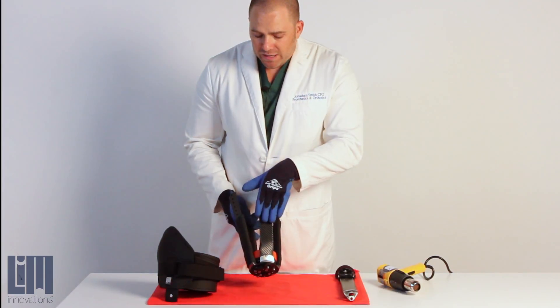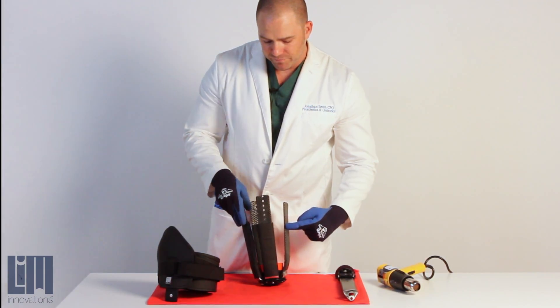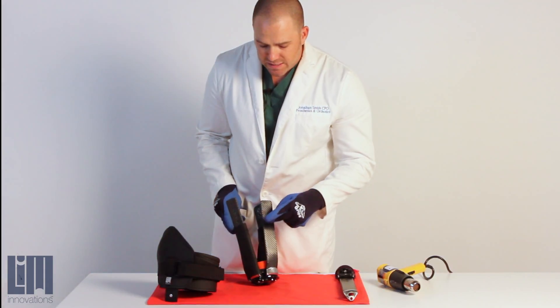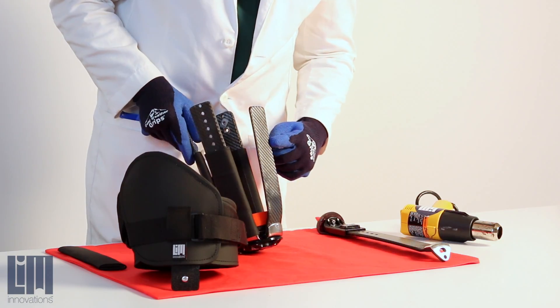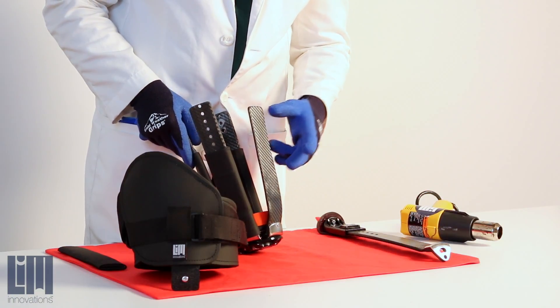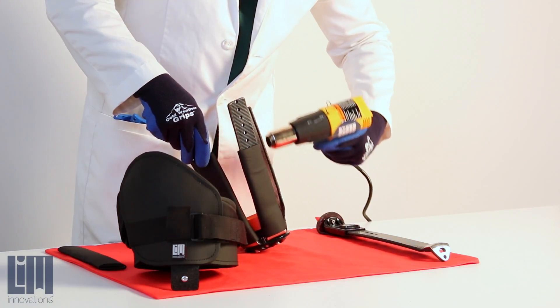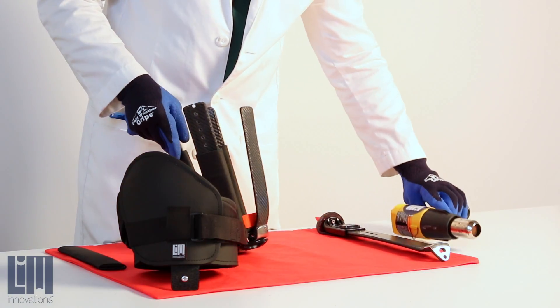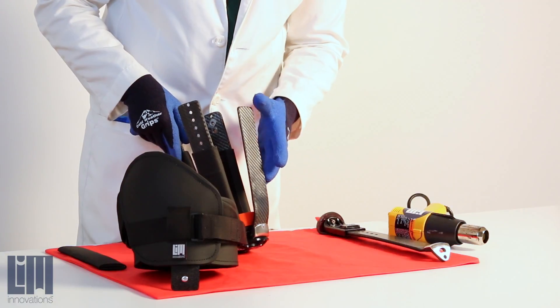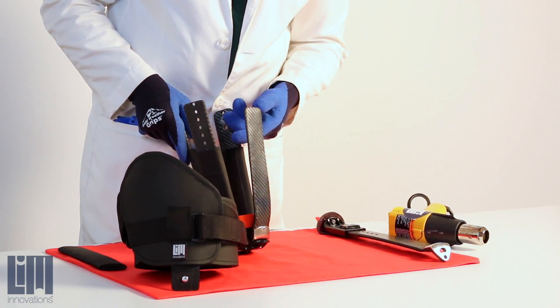Let's say that we want to bring in this portion of the brim and make an angular change right here. We're going to heat up a wide range of the strut itself. As you move the heat gun around, move it in circles or whatever your technique may be, but make sure you're applying a nice even heat over a broad area — much more broad than where you want your contour.